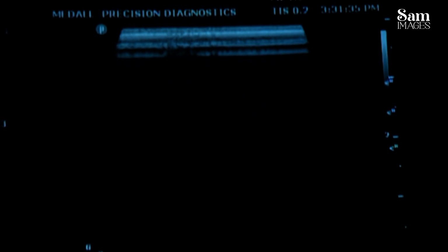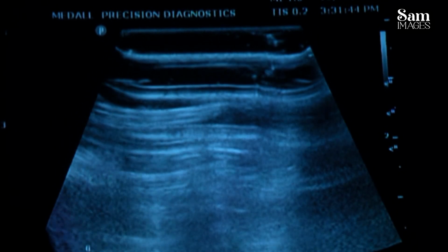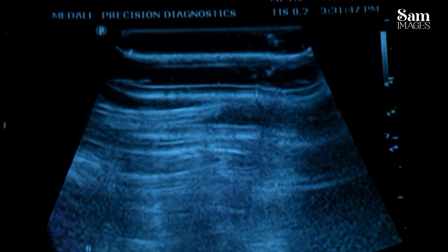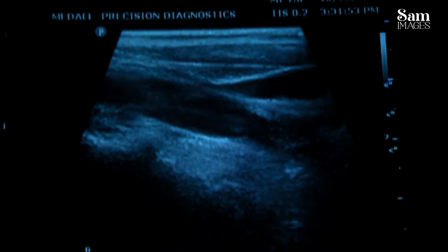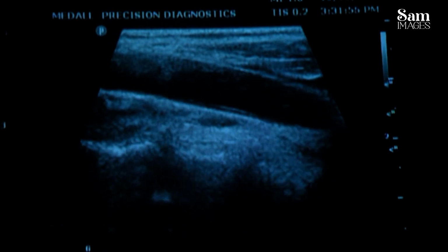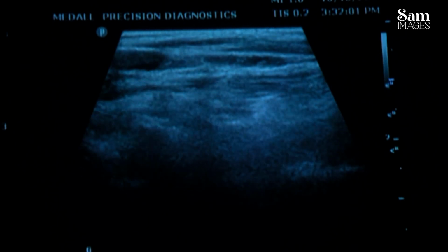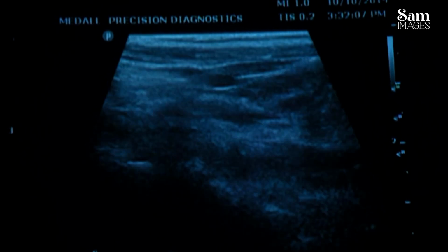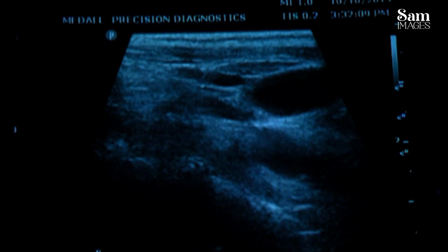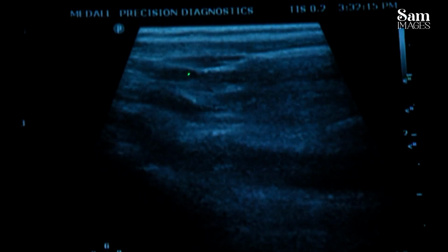Okay. Then I'll change my probe direction. See, this carotid artery will be the landmark for us. You see the intima and then the pulsating one. Yes. So just above, I am just taking it. I am seeing the upper deep cervical lymph node, that is one, and then this middle small lymph node. It is not very significant. That one above is the lymph node.